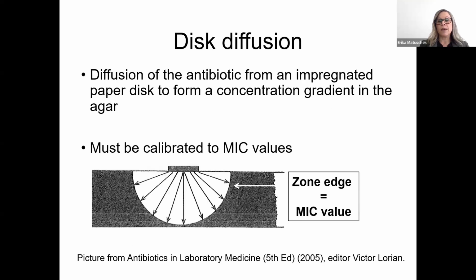Disk diffusion is based on the antibiotic diffusing from a paper disc impregnated with an antimicrobial agent to form a concentration gradient in the agar. And I think this picture describes it very nicely. Here we have an agar plate, and we have the inoculum on the agar surface, and then we have the antimicrobial disc.